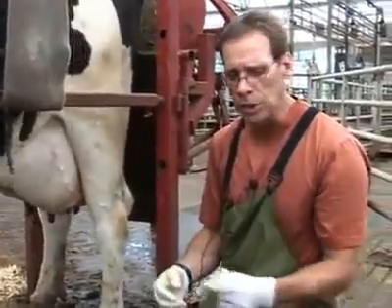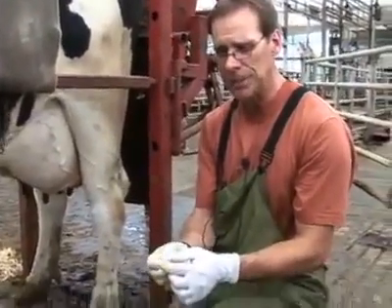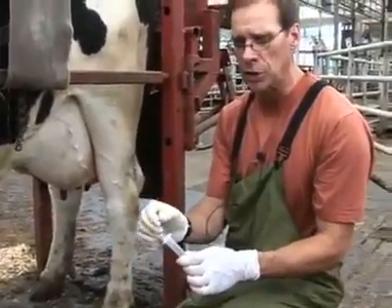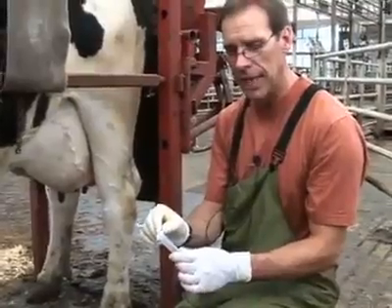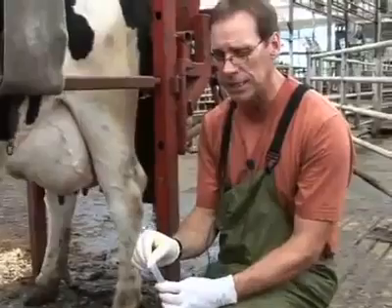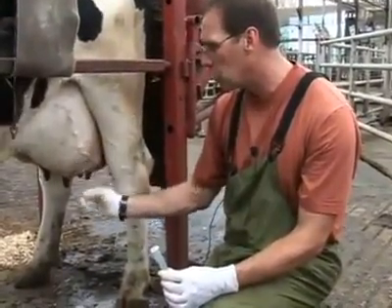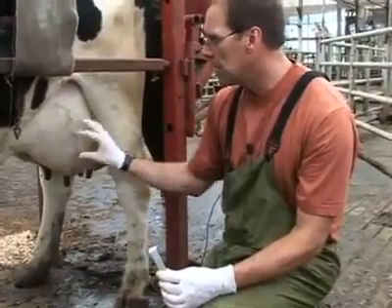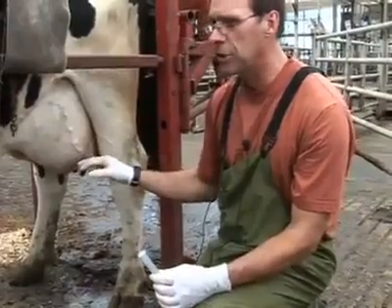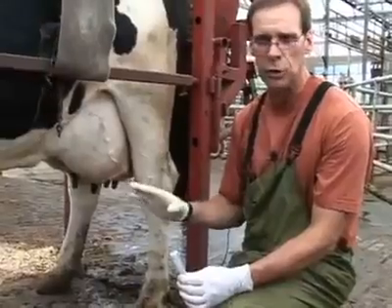So we will use a sample vial, a plastic sample vial, to collect our milk. It's a sterile tube. We have to be careful when we open the tube that we do not touch any of the internal parts of the cap that could contaminate our vial. Also, a very important part of taking this sample is that every time you move the teat or the gland, there are many different types of particles, from hair to dust to all kinds of debris, that can fall into your sample vial. So you want to be careful to avoid those.